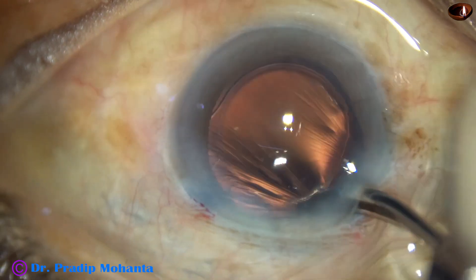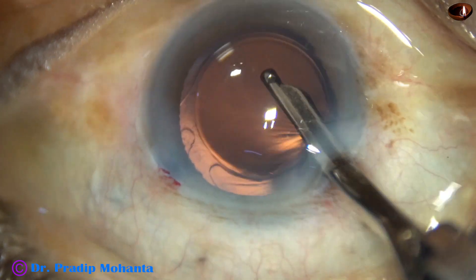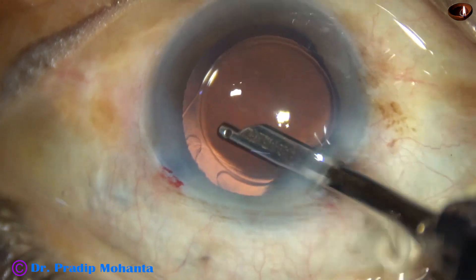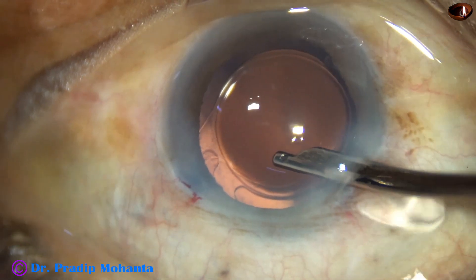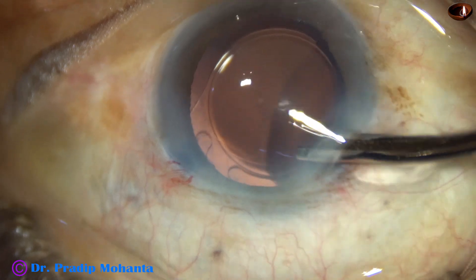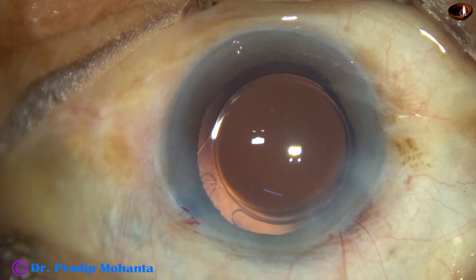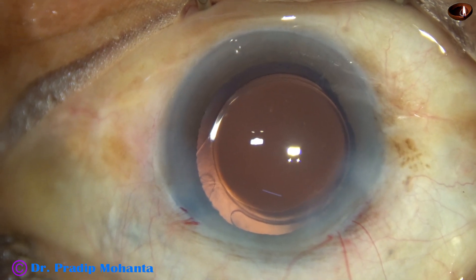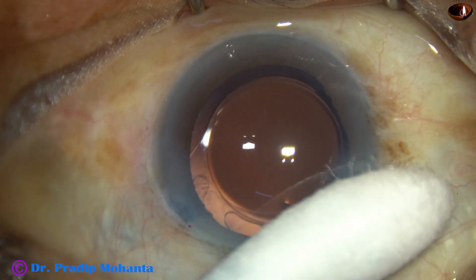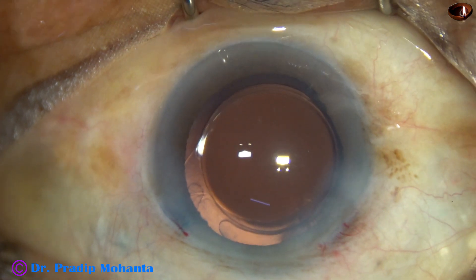This is the final lavage of the anterior chamber. The capsular bag is irrigated, the anterior chamber is irrigated, and any viscoelastic particles are removed. The anterior chamber is nicely formed. The integrity of all wounds is checked with a cotton tip and Jensen bar. A few drops of moxifloxacin are applied over the ocular surface, and the case is concluded.